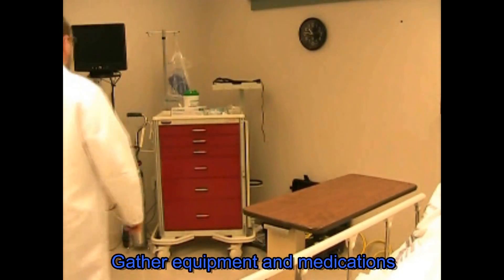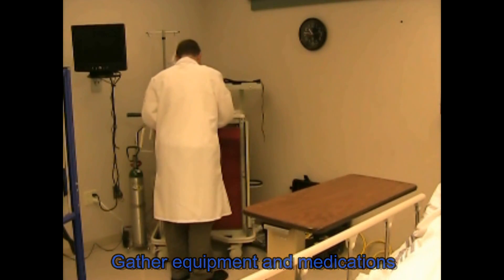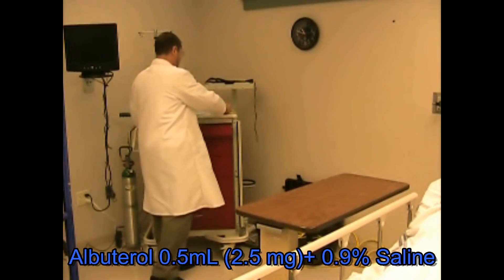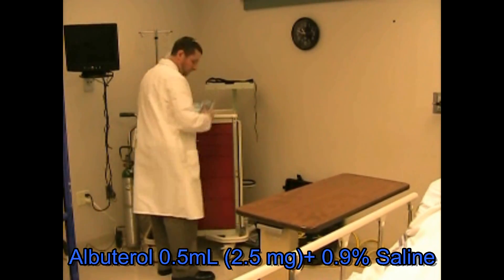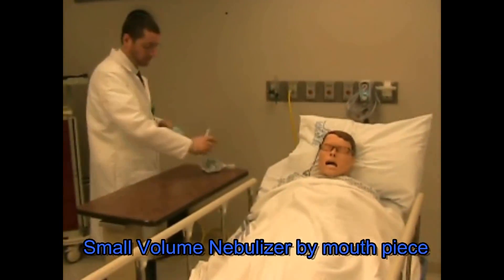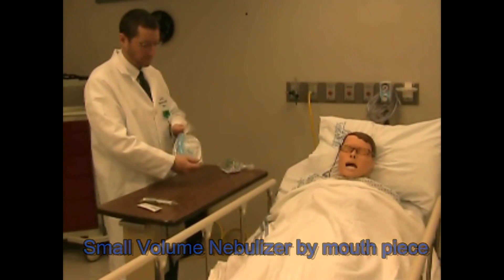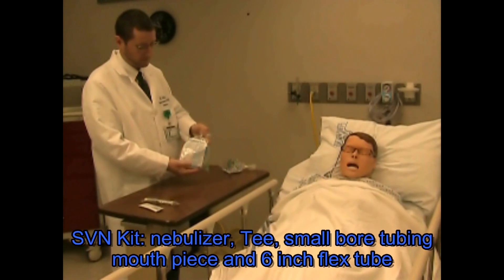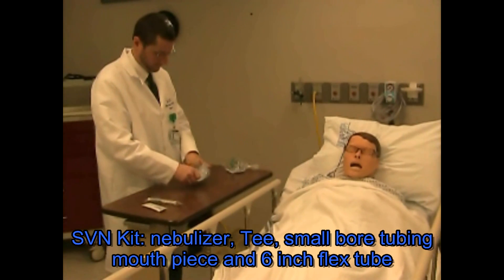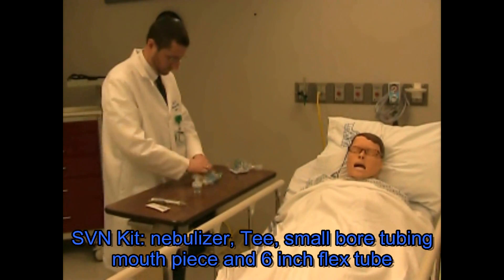The therapist will gather the equipment and the medication. In this case the patient is getting albuterol 0.5 mL and a saline syringe, and will bring to the patient the nebulizer and the delivery system. The nebulizer will often come prepackaged with tubing, nebulizer, mouthpiece, and flex tubing. Flex tubing should be used as a reservoir.